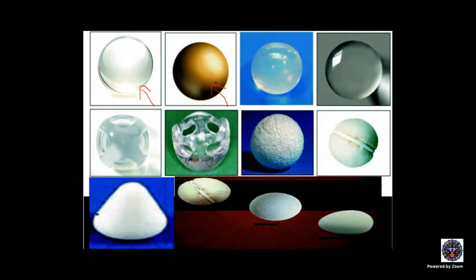It was a heavy material, whereas silicone does not weigh as heavy as glass. So silicone gets better centered as compared to glass. PMMA is even better. It is lighter than silicone. So PMMA does not sag down by gravity. It remains even better centered. So all these are various examples of spheres, right?